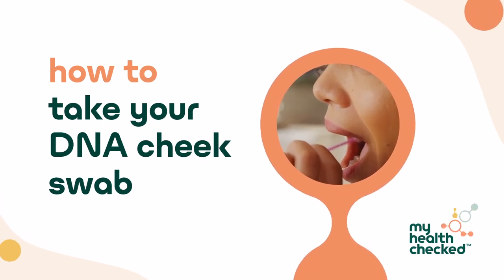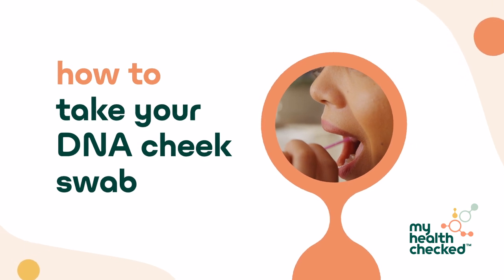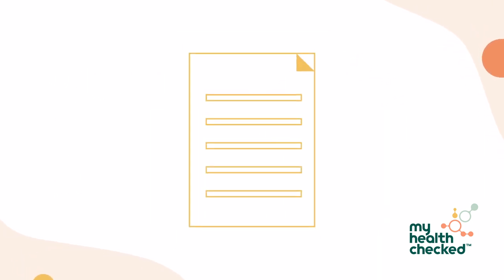Thank you for using My Health Checked. This video explains how to collect your DNA cheek swab sample. Before you start, make sure you have read and understood the instructions.